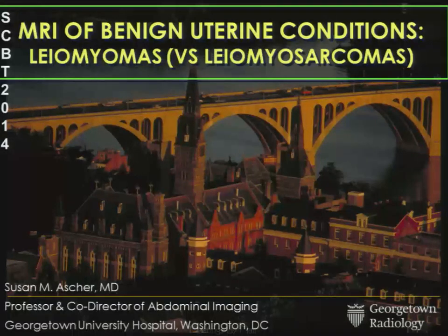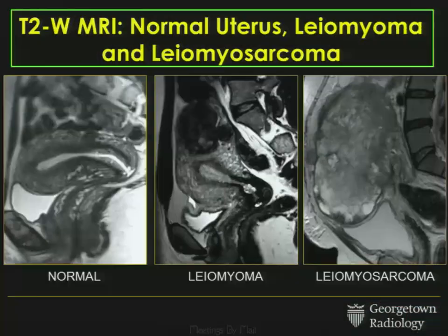I kind of renamed it: Leiomyomas versus Leiomyosarcomas. We all know that the T2-weighted sequence is the workhorse for imaging the uterus. On your left is a typical normal uterus on the T2-weighted image. In the middle is a patient who has a pretty garden-variety fibroid. And on your right is a patient who has a florid leiomyosarcoma, basically effacing all normal uterine anatomy.